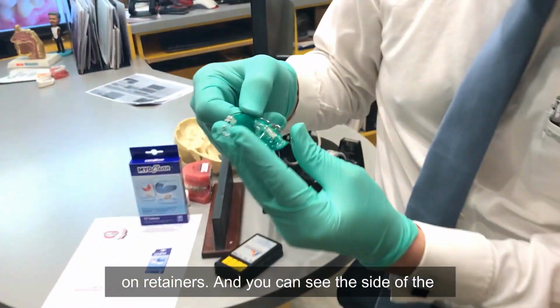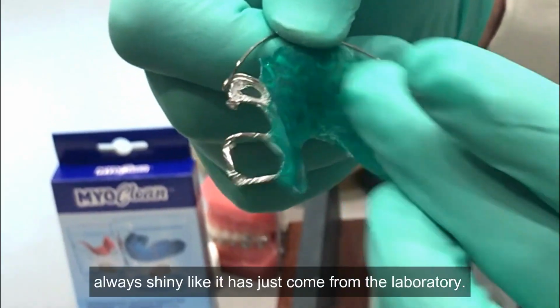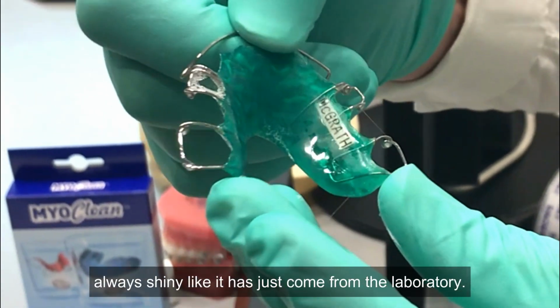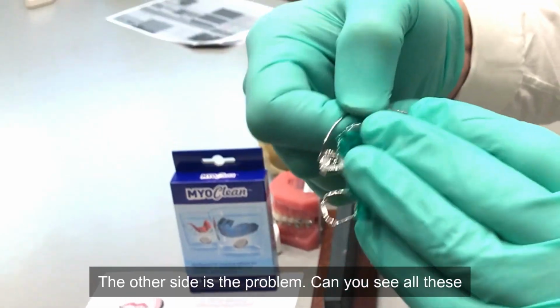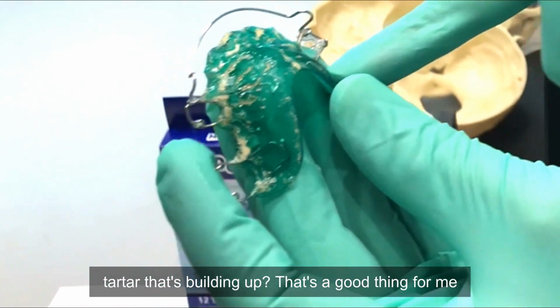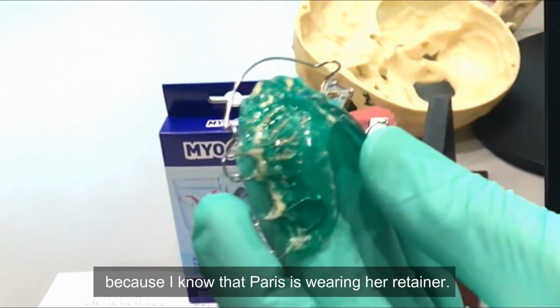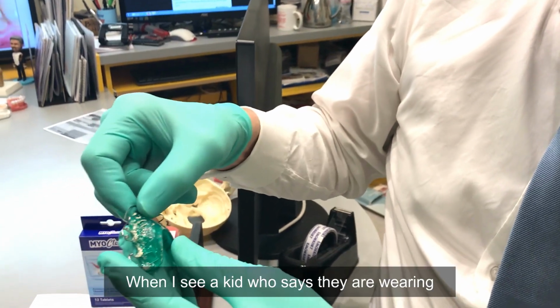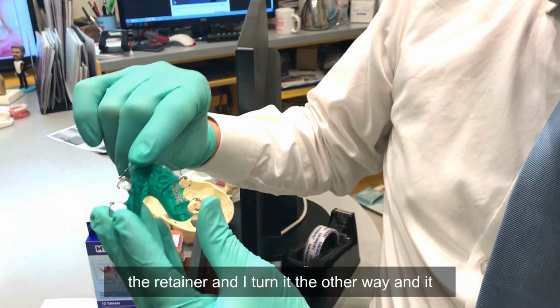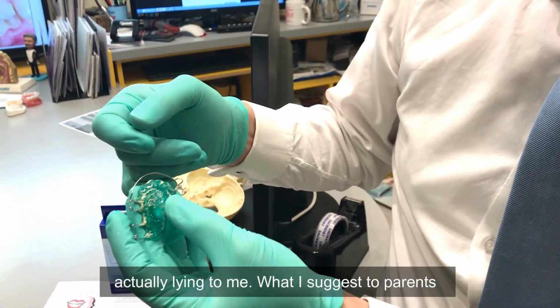Now you can see the side of the retainer that's not in contact with the palate is always shiny, like it's just come from the laboratory. The other side is the problem. Can you see all this tartar that's building up? That's a good thing for me because I know that Paris is wearing her retainer. When I see a kid who says they're wearing the retainer and I turn it the other way and it looks like it's just been made, I know they're actually lying to me.